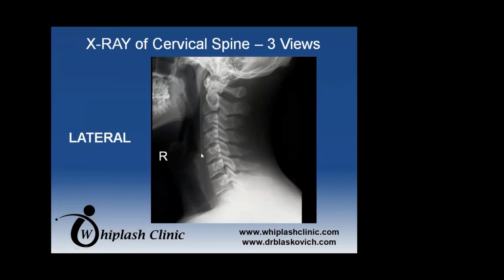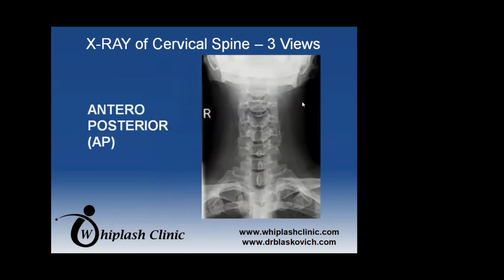So it's got to go through the front part of the body, the back part of the body, and the rest of the body, then go through a facet joint, then go through the spinous process and out the back through the skin and the muscle. So there's a lot more things to penetrate, whereas from the side, it's literally the side of the vertebra and then the discs in between the vertebra, and then it goes out the other side so we can see the spacing much more nicely. And the way the facets are oriented, we can see them much better as well on this lateral view.